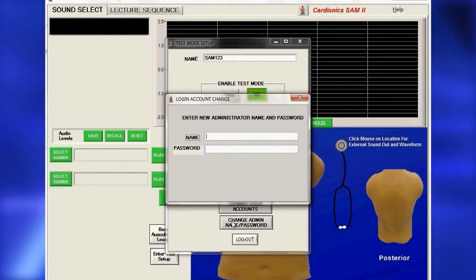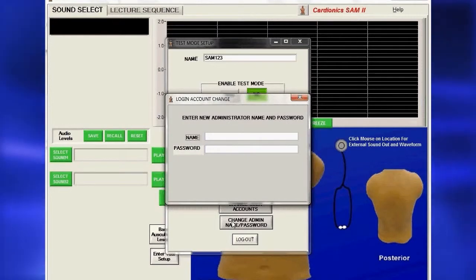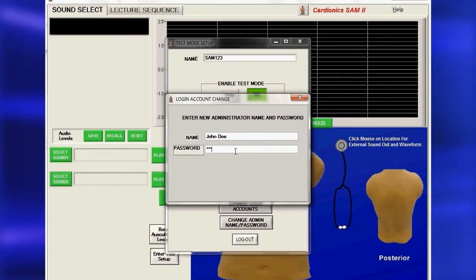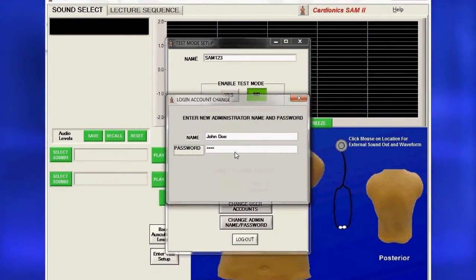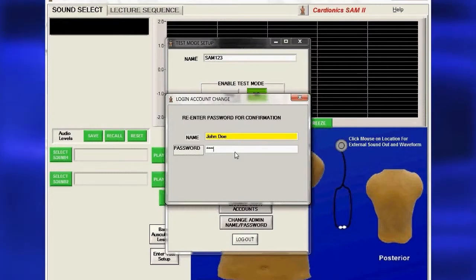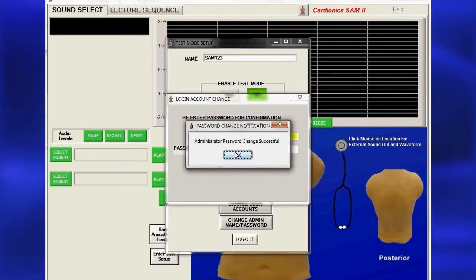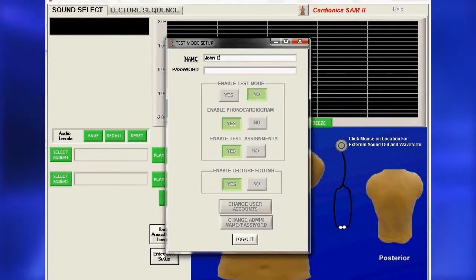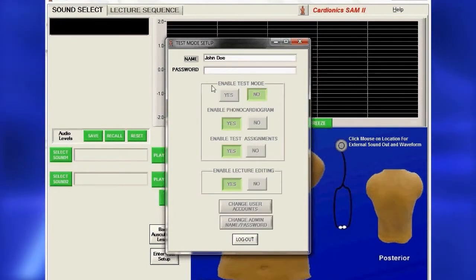You should change the name and administrative passwords from the factory default. Click Change Admin Name Password to bring up a dialog. Fill in the name and select a new password. You will be asked to enter the password twice, and a message will confirm that it has been successfully entered. Press Enter and a dialog will appear with the new name. You must log out to complete the password setup. A password is required for instructors to edit lectures or use the Student Assessment Program.